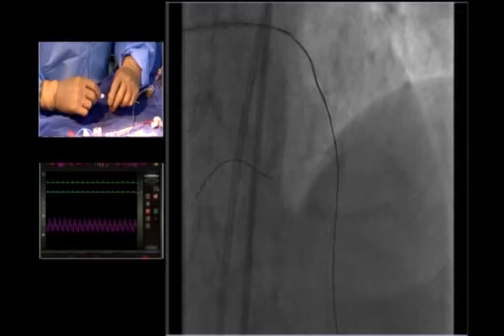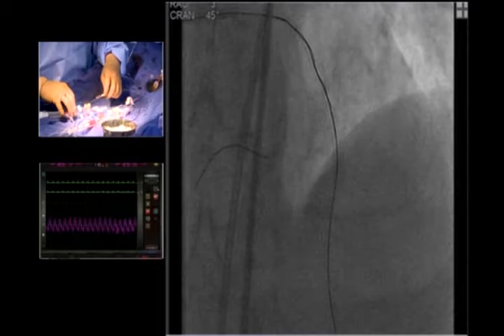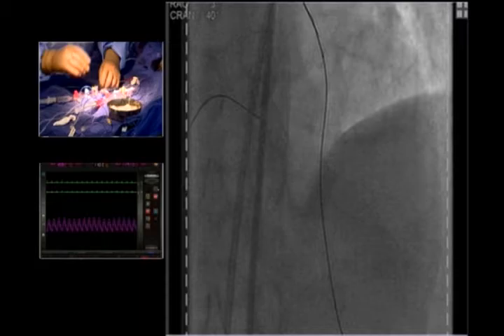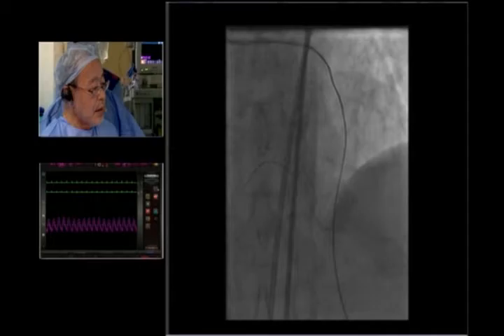You might have to, at the end, pull all the gear out and rewire this, unfortunately. Pull wire and Tornus together. I cannot advance XTA anymore because of the tight grasping here. Okay, then I will try to move the wire in the Tornus. Can I see the tip of the wire? You want to reduce the cranial? Okay. And put in Caravel. Sure. Okay, and can I see?